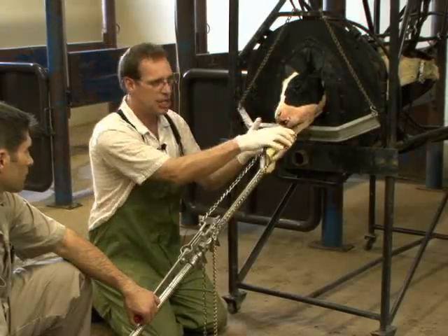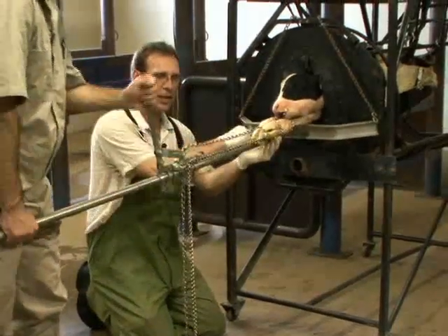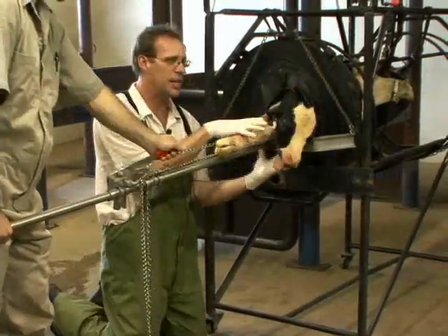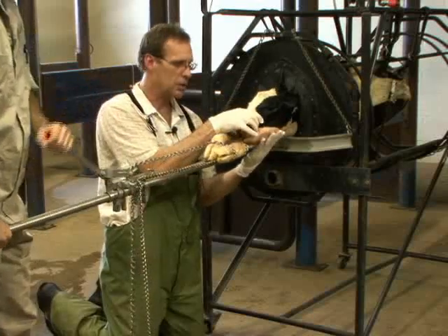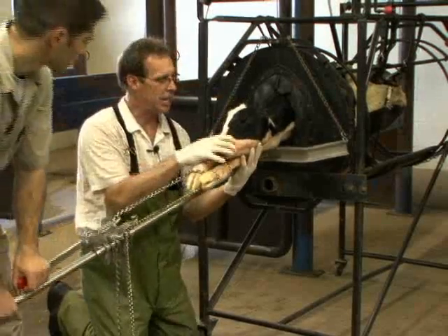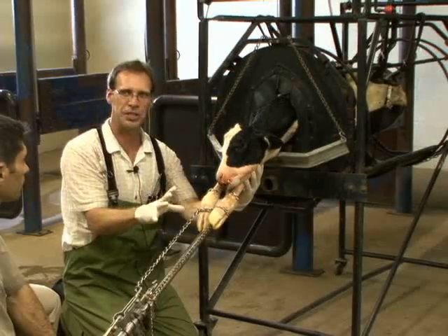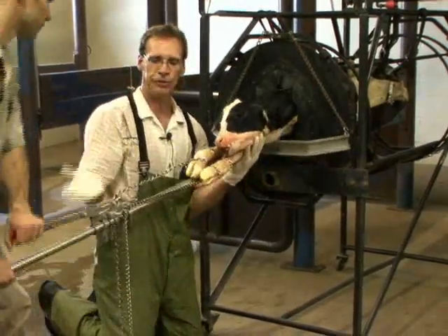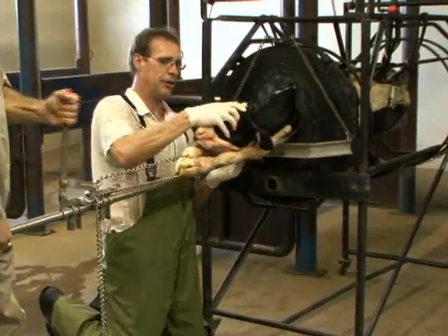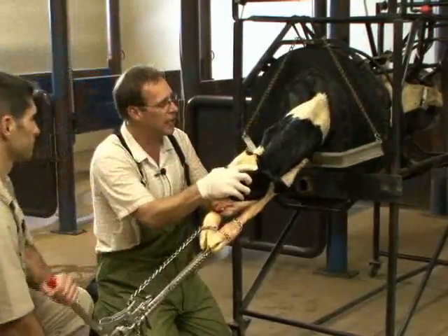Once we have that tension and force on the calf, we lift that end back up and crank a few more times. You can see the calf is being delivered. We keep cranking, slowly paying attention that everything is in alignment. If we want more assistance and leverage, we take the end down and get more calf coming out of the cow. We're now almost finished with the delivery, so we lift up again and do a few more cranks. The calf is coming in normal presentation, position, and posture. We take the end down again to get more calf out.